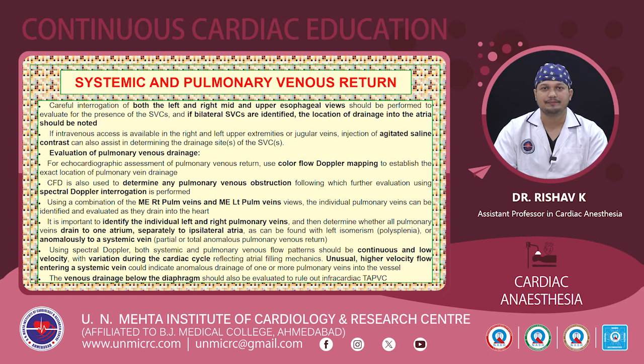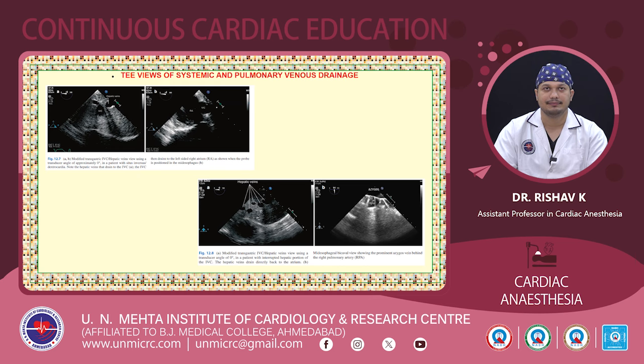Using spectral Doppler, both systemic and pulmonary venous flow patterns should normally be continuous and low velocity with variation during the cardiac cycle. Unusual higher velocity flow entering a systemic vein should indicate anomalous drainage of one or more pulmonary veins into the vessel. And also the venous drainage below the diaphragm should be evaluated to rule out infracardiac TAPVC.